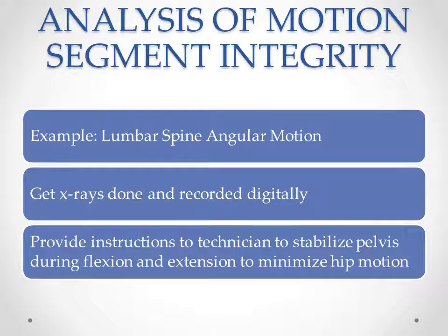Okay, and so with those instructions in mind, we're going to go through a procedure for doing an analysis of lumbar spine motion segment integrity. And I refer you to the PowerPoint presentation where this is laid out for you in step-by-step fashion.